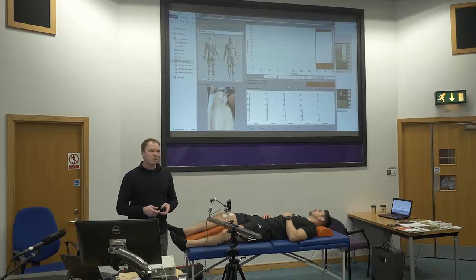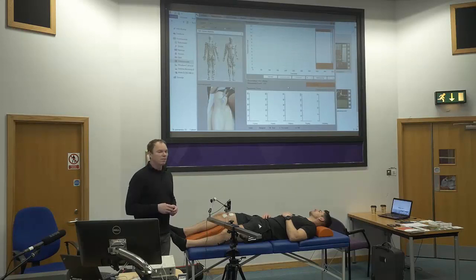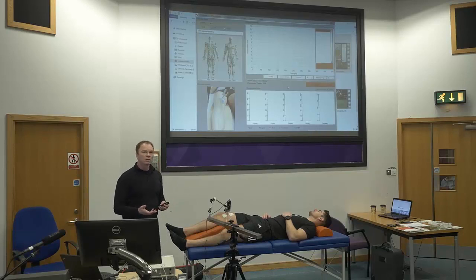If the skin is dry, you will need a little bit more current. If you have a little bit more fat tissue, you will need a little bit more current. If you have electrodes which are dry, you will need a little bit more current. So, because you never know how much, you start low — around 20.